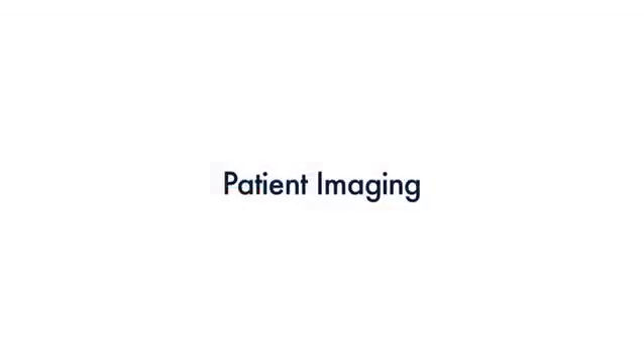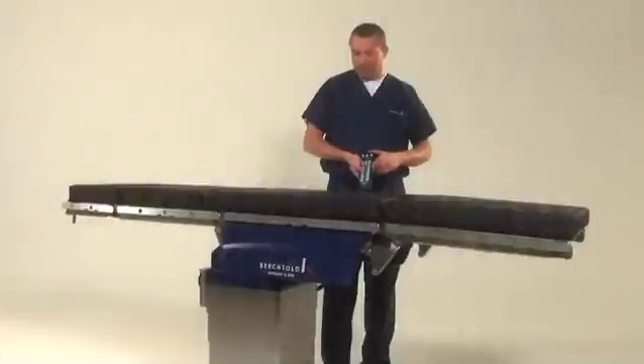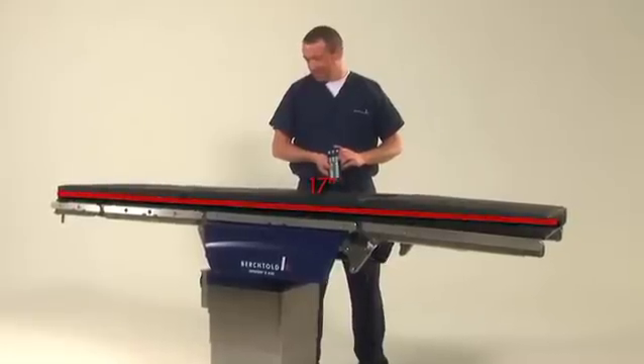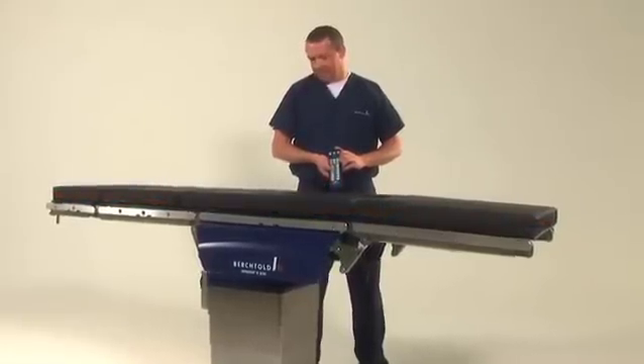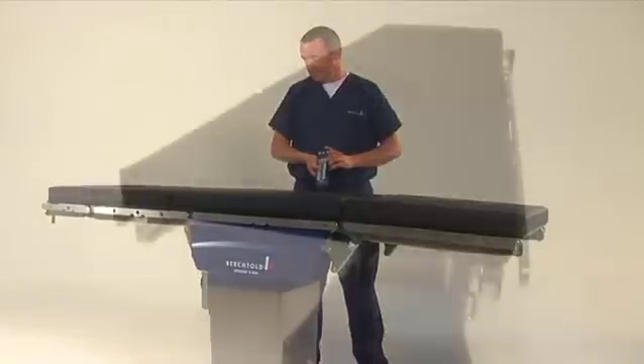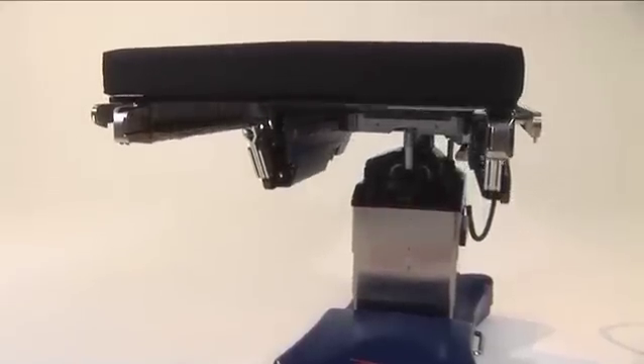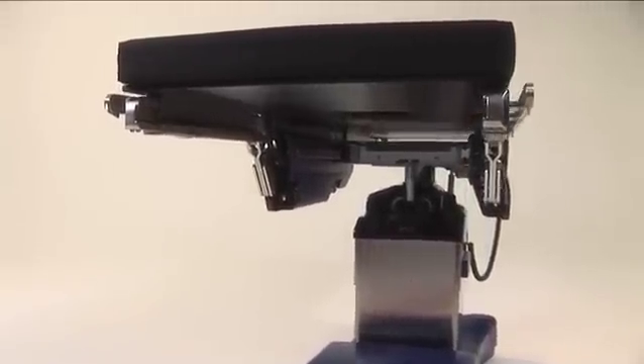The D850's carbon fiber tabletop construction improves image clarity while minimizing risk of exposure to patients and OR staff. 17 inches of longitudinal slide provides superior C-arm coverage without the need to reposition or reverse the patient. The space between the side panels is open, allowing the C-arm to slide all the way to the column.